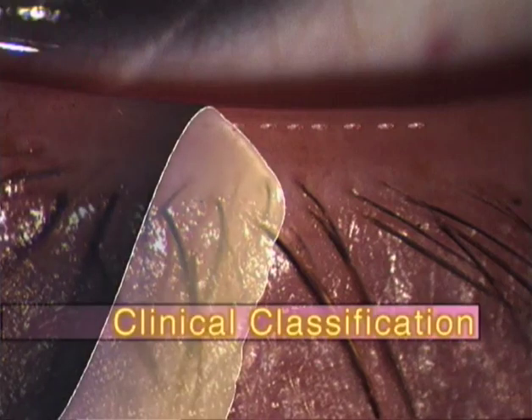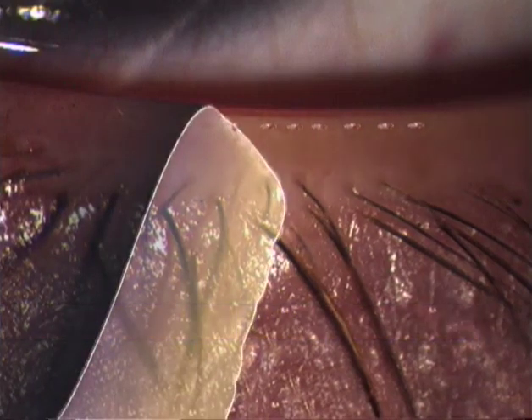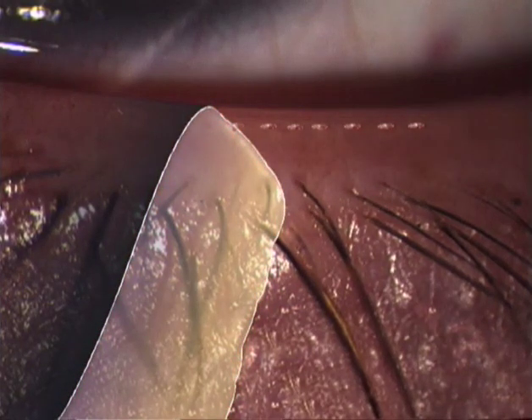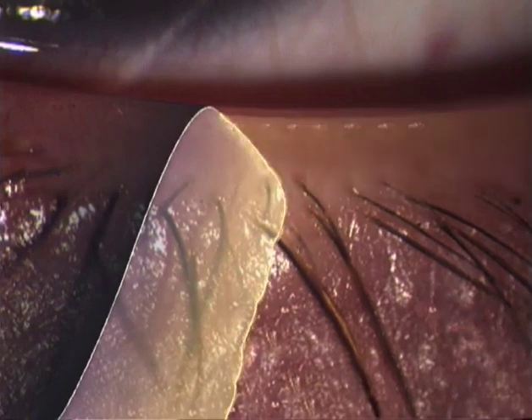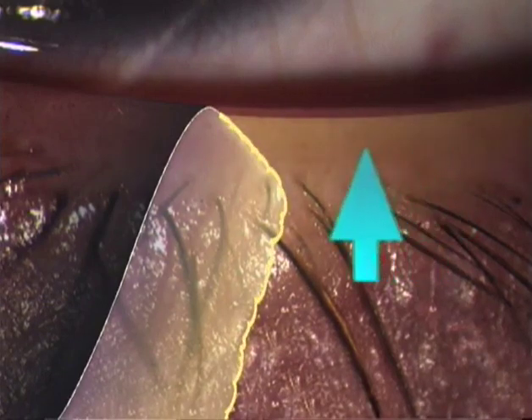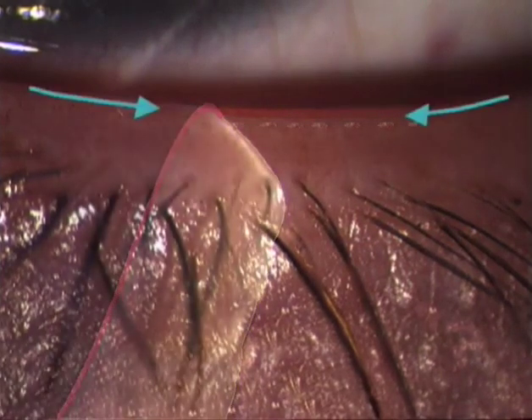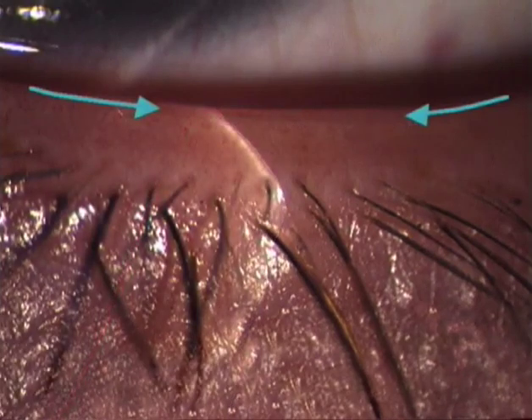For the clinical evaluation of the relationship between lids and globe, it is the surface of the lid margins which is the main target of interest, and thus a different subdivision is used: the differentiation between the cutaneous part and the conjunctival part. For this differentiation, the separating border lies internal to the tarsal glands.